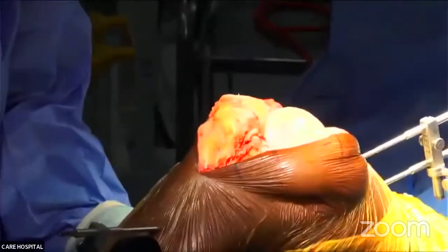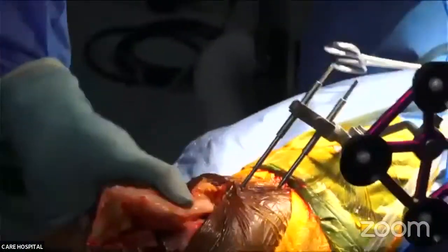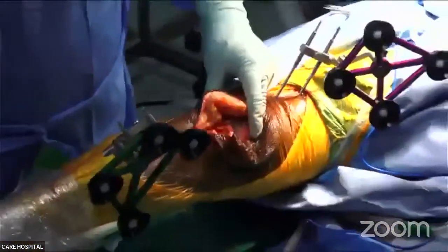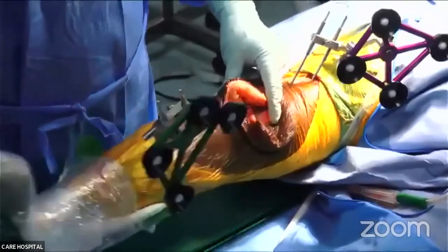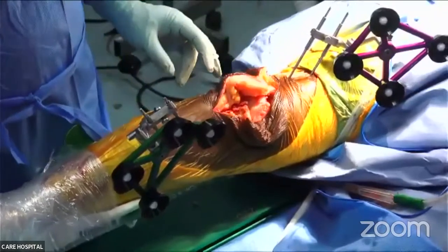And we have applied the trackers. You can see that there is a lot of varus instability. Can you appreciate that? Yeah, we can. Actually, before that, can you just tell us how you put that tracker?